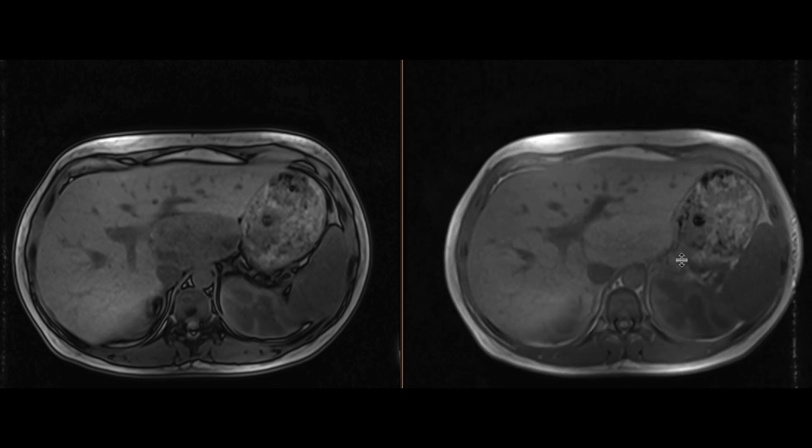So essentially, a fat-containing mass in a young 30-year-old female patient with arterial enhancement, some washout, and hypointensity on the hepatobiliary phase — this is a classic imaging appearance of a hepatic adenoma. This was resected, and indeed turned out to be an adenoma.